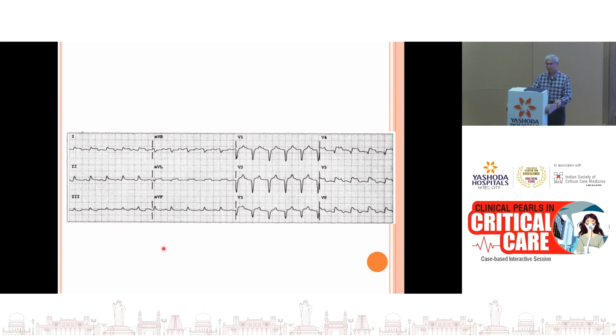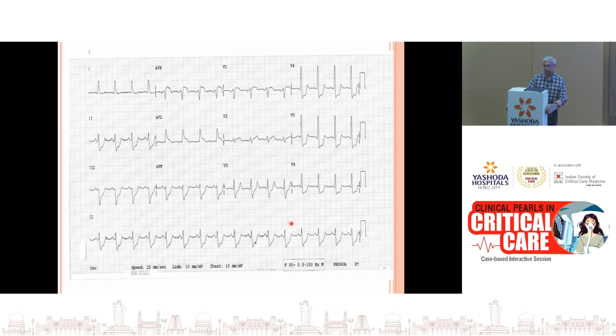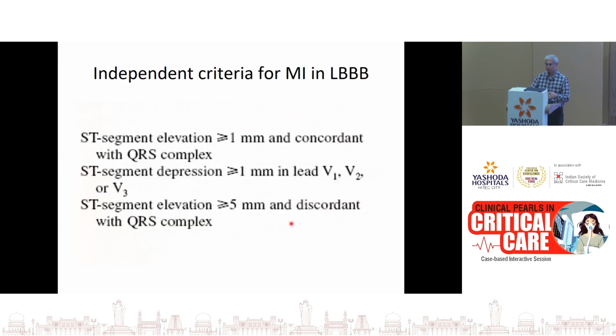And this is an example of a patient who has a massive global infarction. You can see ST elevation in practically every lead. And finally, my last 2 slides.